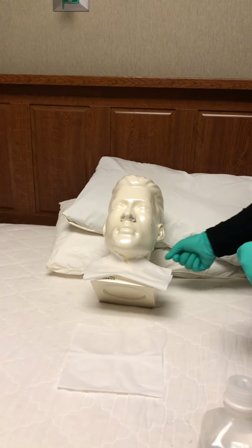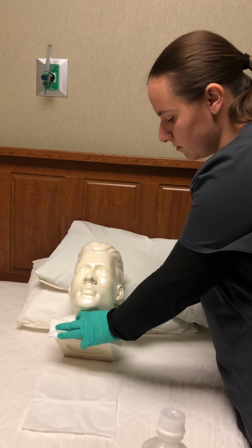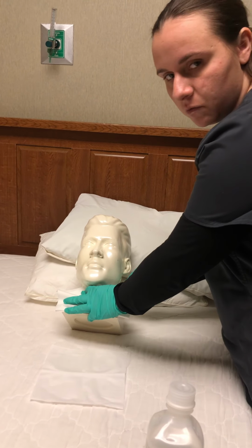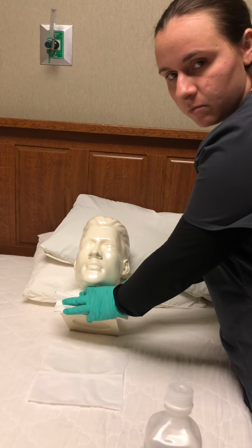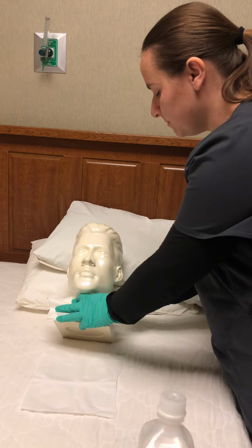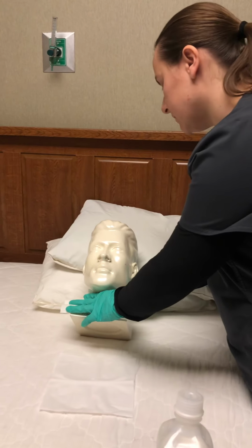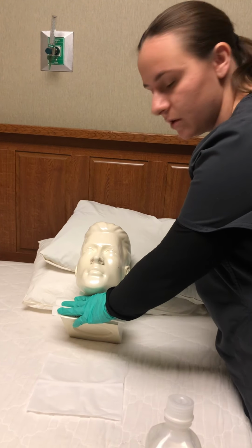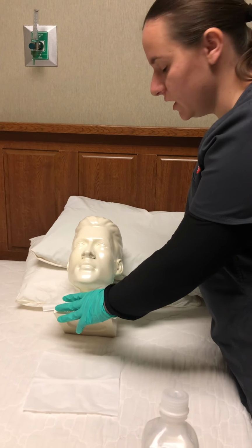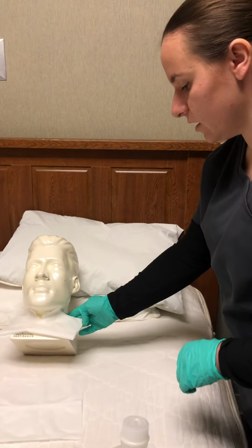And then if you need to, you check the band. Sometimes the band may need to be removed. So you would always hold the neck plate in place and carefully remove it, making sure you don't move your trach that's in place, so you don't have any complications, like air in other places where it shouldn't be. And then you would replace it. If you feel more comfortable, you can have somebody hold it while placing the new one on. But always make sure you can fit 2 fingers underneath the band, so you know it's not going to cause any sores around their neck area.